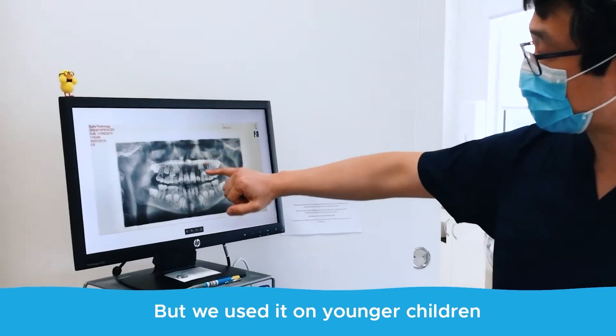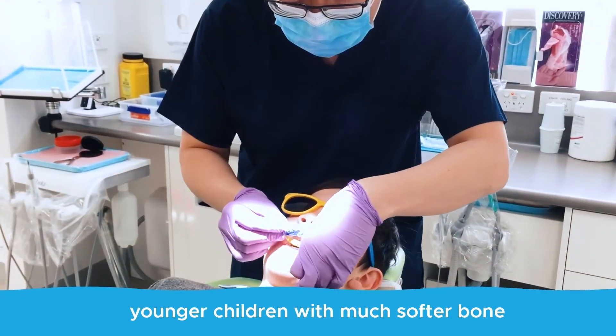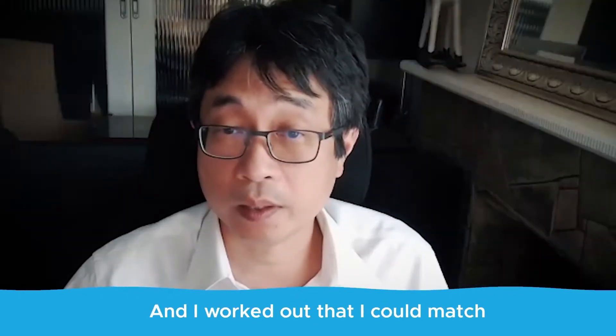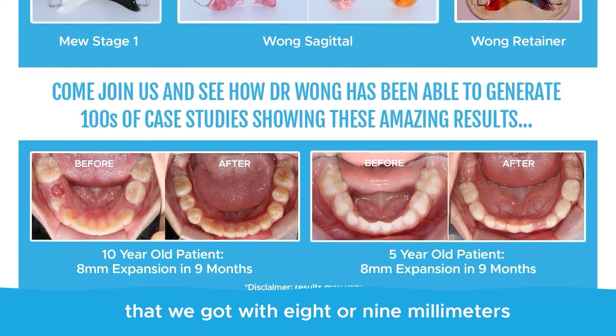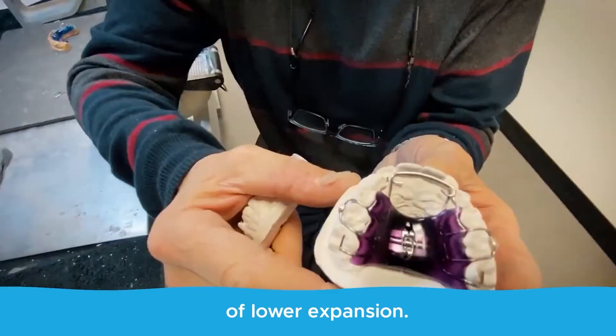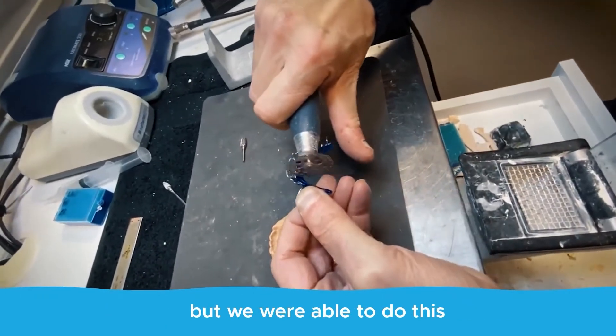We used it on younger children with much softer bone and more adaptability in their growth. I worked out that I could match that eight or nine millimeters of upper expansion with eight or nine millimeters of lower expansion. It took about nine months to achieve, but we were able to do this.